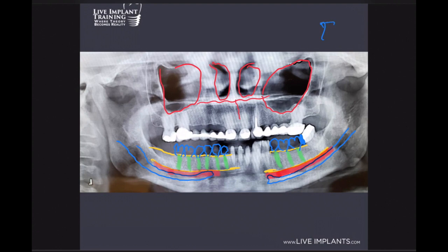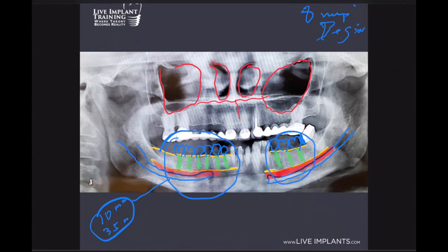This is a simple beginner case — any beginner can do this. It's an eight-implant case and we want to accomplish all of this in three hours. We want to make all implants the same length and height. Anytime we're on top of the nerve, we're looking at 10 millimeters as a safety depth. For diameter, we're probably looking at 3.5mm, and in the back we usually go a little wider at 4.3mm.